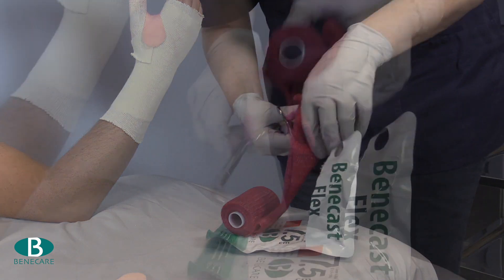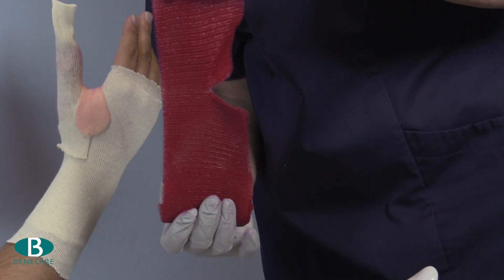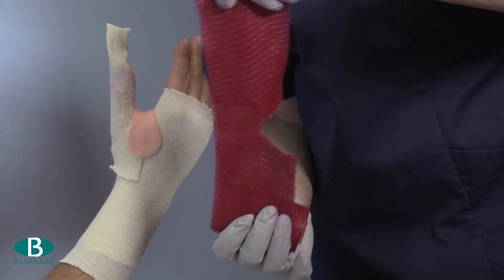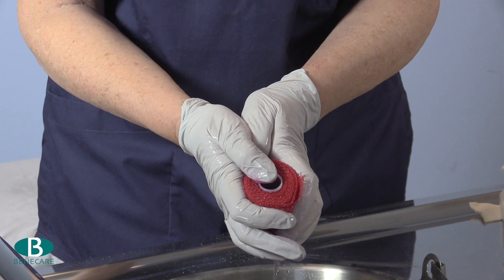Now dip into room temperature water with a gentle squeeze to remove any excess moisture. This material can be used dry and over-wrapped with a wet bandage to provide more working time.